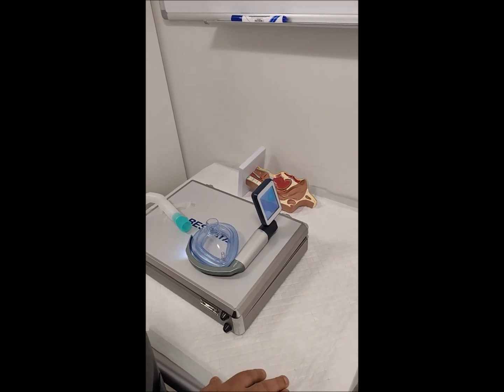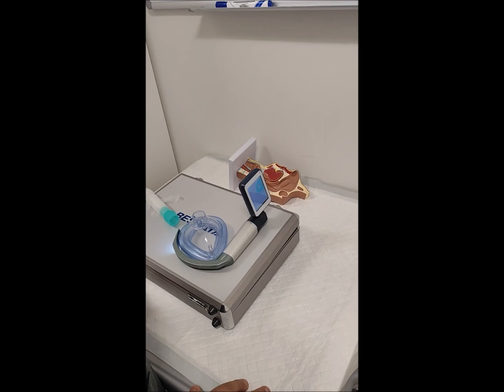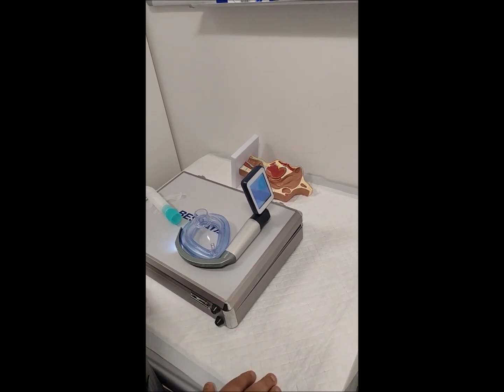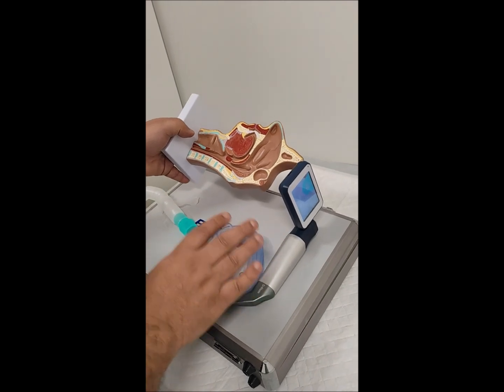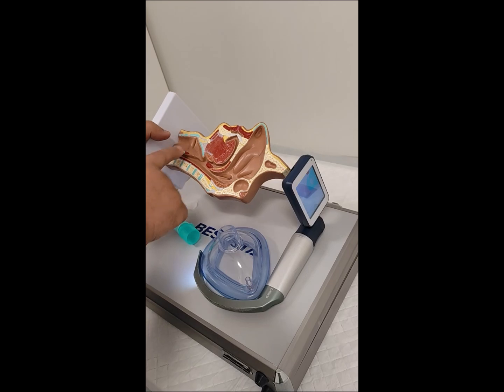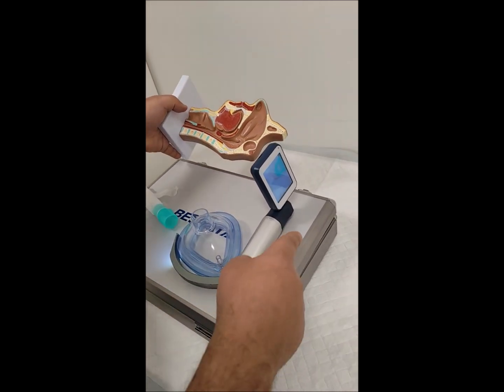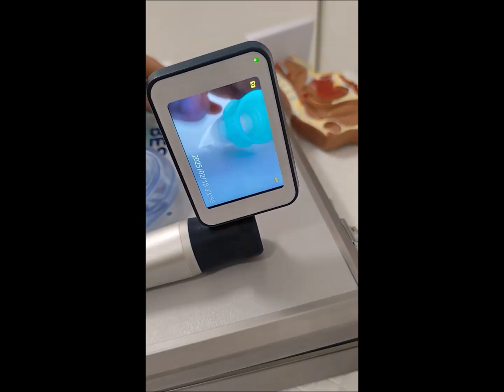Today we will discuss difficult intubation, how to manage with a glidoscope or video laryngoscope. In this table we have a model patient — this represents the tongue and this tube represents the larynx. As you can see, the larynx is visible here but it is positioned high.